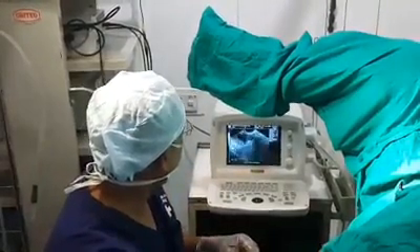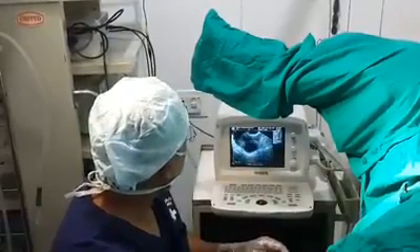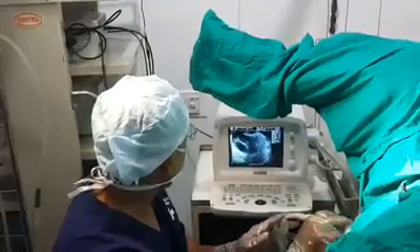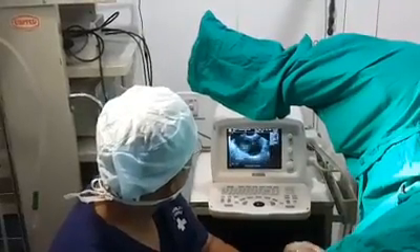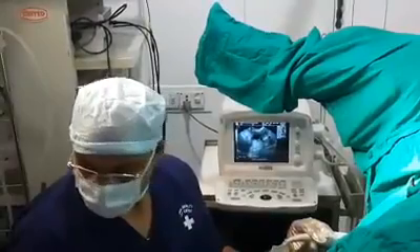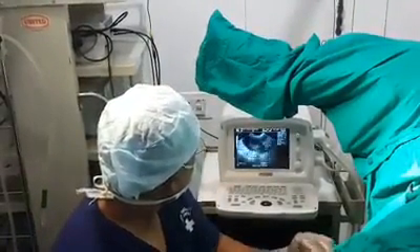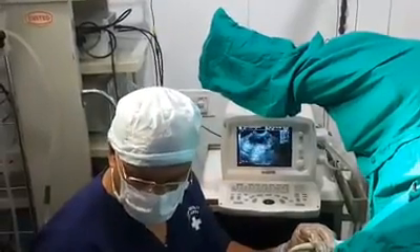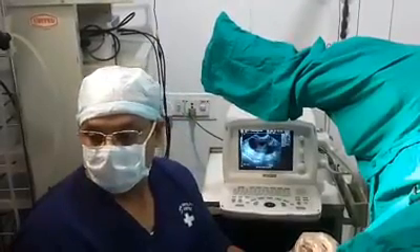I will be using one needle with which I will be picking up all the follicles. This procedure is called ovum pick-up or oocyte retrieval. The patient is under propofol anesthesia and I will be taking the ovum pick-up needle. This ovum pick-up needle is single use.